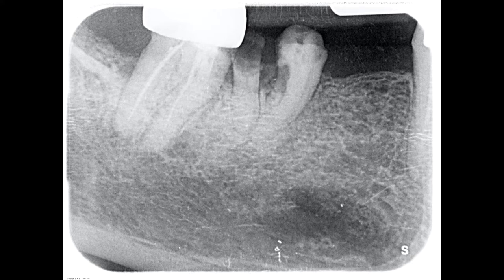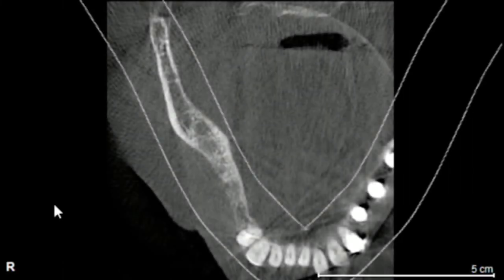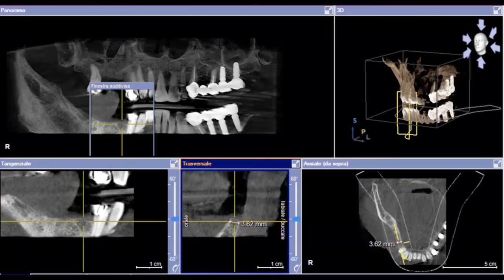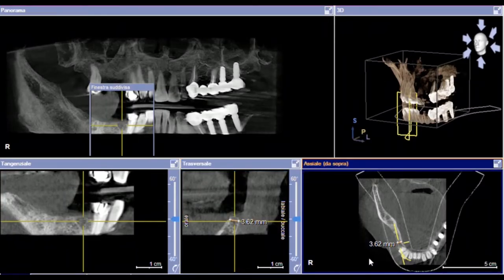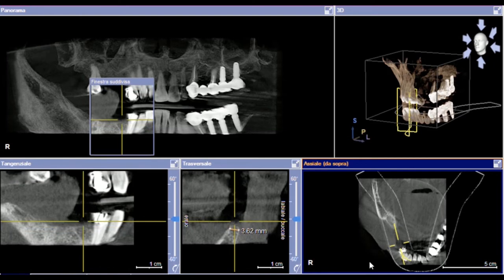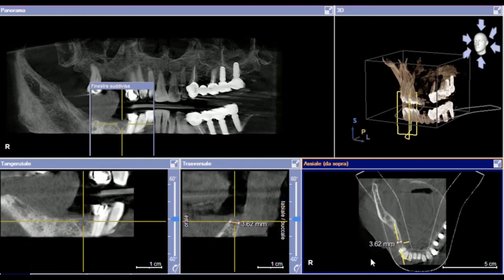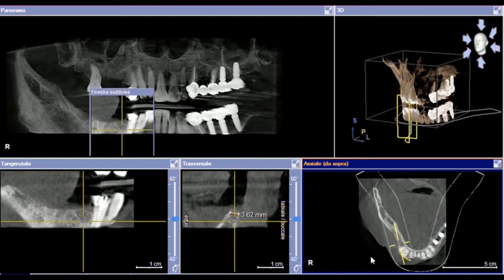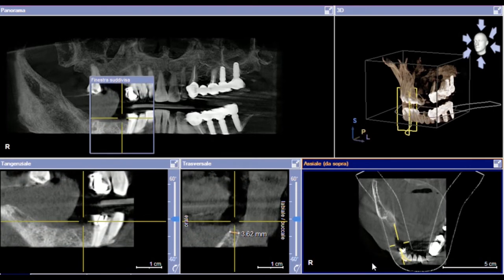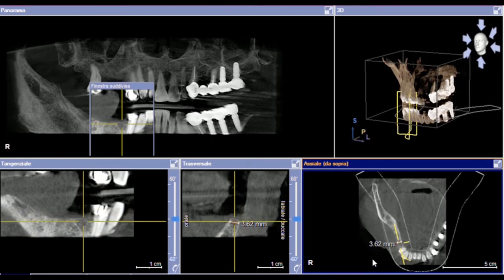As you can notice in the x-rays, there are two teeth that have been extracted before the surgery. Three months after tooth extraction, the patient did a CBCT, and from the CBCT you can notice that there is a concavity in the lower right mandible.